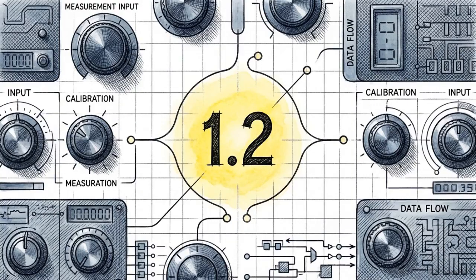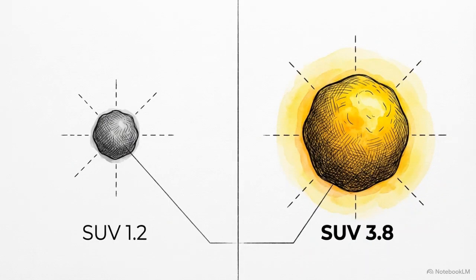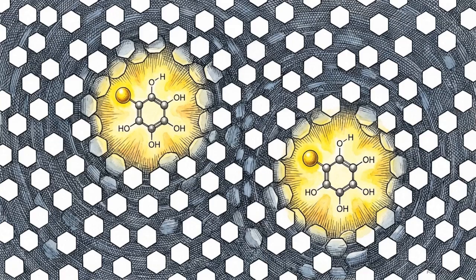We measure this accumulation using the standardized uptake value, or SUV. This number describes exactly how much FDG a lesion drinks. Clinically, values above 2.0 or 2.5 are flagged as abnormal, indicating high metabolic activity. This brings us to a critical biochemical vulnerability.